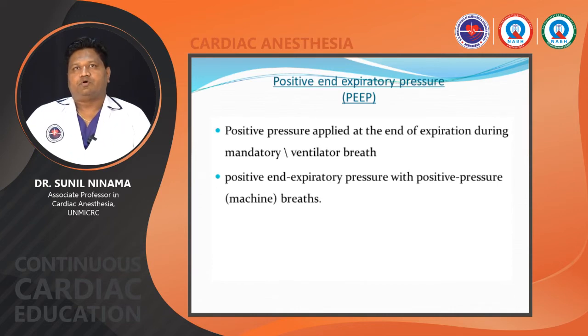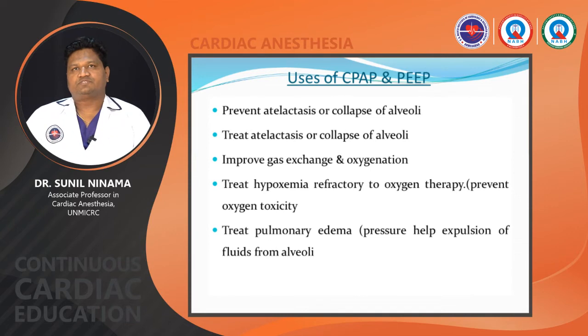Then there is PEEP, positive end-expiratory pressure. This is positive pressure applied at the end of expiration during the mandatory ventilatory breath. Uses of CPAP and PEEP: it prevents atelectasis and collapse of alveoli, treats atelectasis or collapse of the alveoli, improves the gas exchange and oxygenation, treats hypoxemia refractory to oxygen therapy, and treats pulmonary edema.